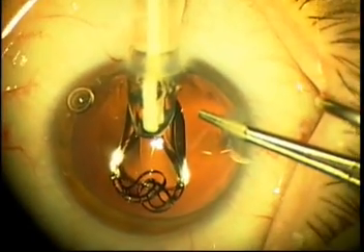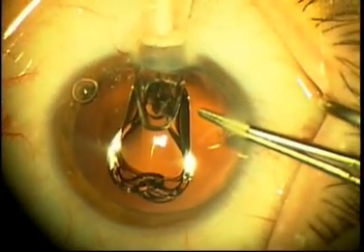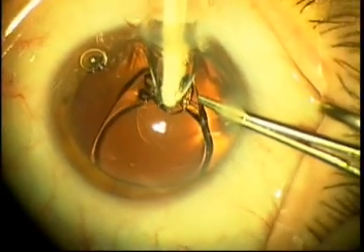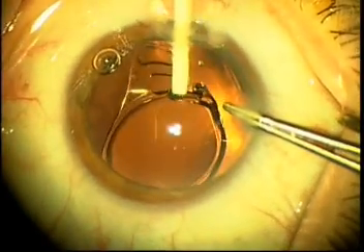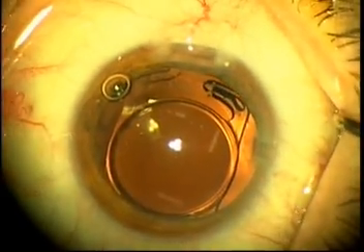You stop right there, allow the lens to unfold a little bit, retract the plunger all the way back behind the trailing haptics allowing the front leading haptics to unfold as you push the lens into the capsular bag and then you simply use the plunger to tuck in the trailing haptics into the capsular bag. This allows for a very slow, well-controlled and well-maintained injection into the capsular bag.